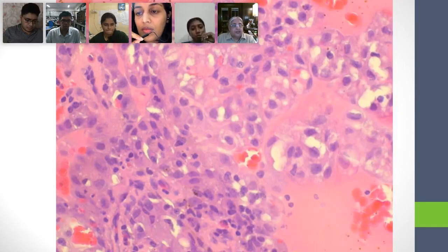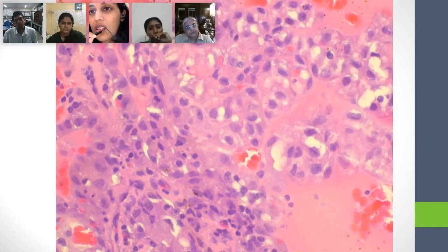All right, here it is at even higher power. Now, come on. Ma'am, again these cells have nuclei and are cuboidal in shape, and the cytoplasmic vacuoles are even more prominent. Yes, so it's multi-vacuolated, not univacuolated.